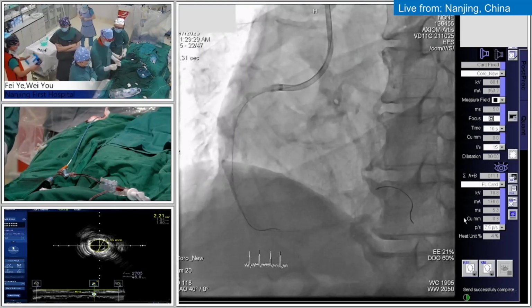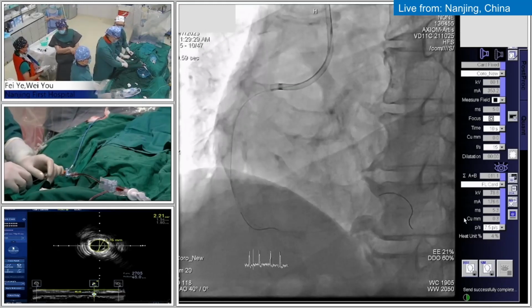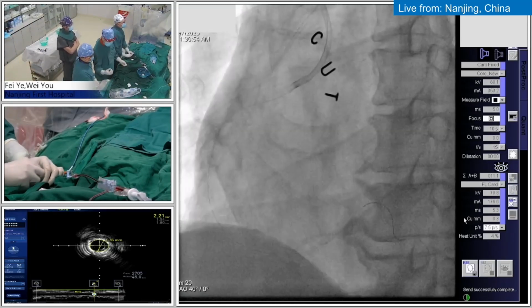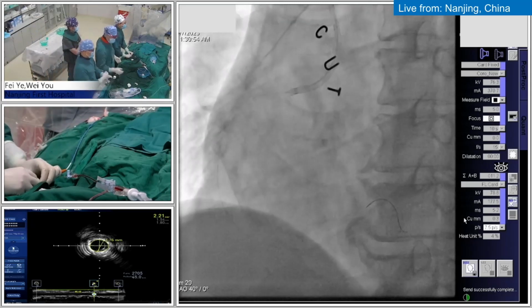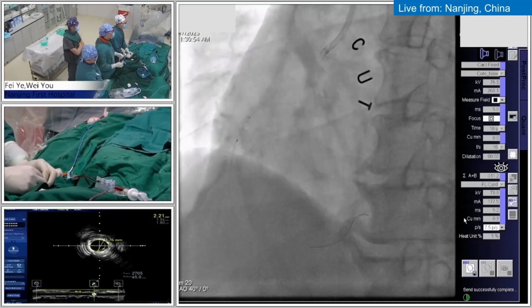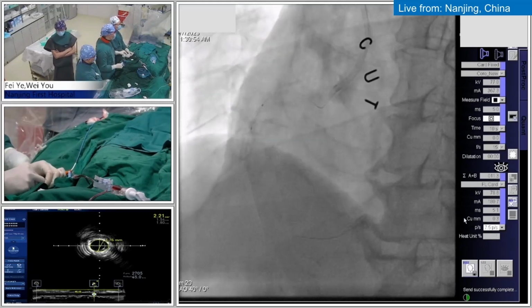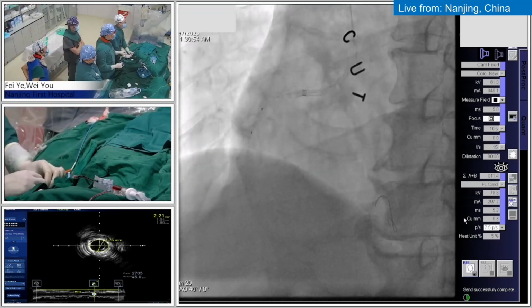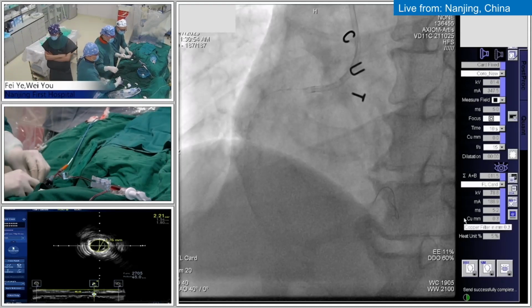Sometimes we want to use a cutting balloon. Cutting is better. This is the cutting balloon. What's the size of the cutting? 3.0. Okay, you can use a cutting balloon. I think maybe cutting balloon cannot push it distally. Agree with you. I will try. What's the guiding catheter? It's the 7 French. Yeah, right. 0.75 or 1.0. Yeah. No, cutting balloon is not easier to push distally. Okay. I will change for the NC balloon. Okay, NC balloon is better.